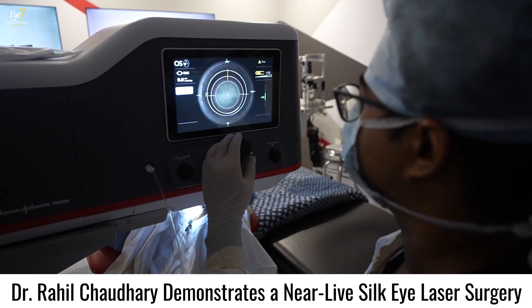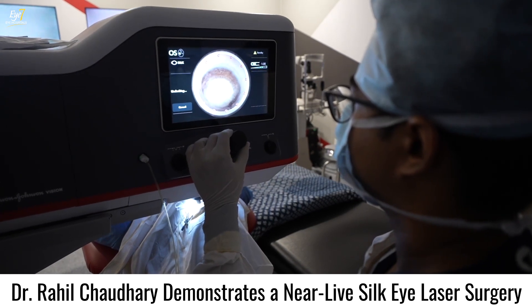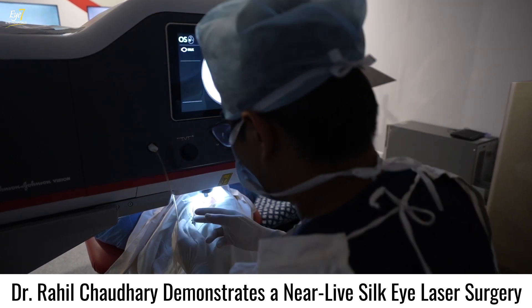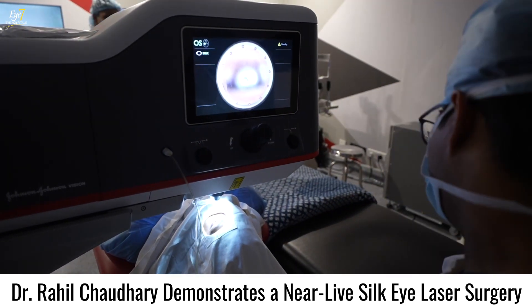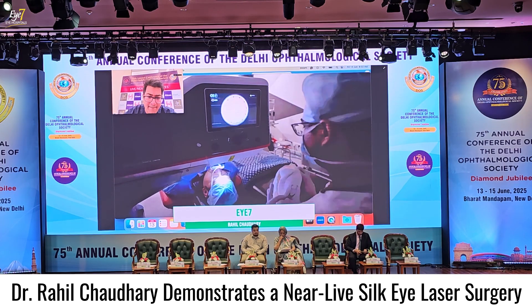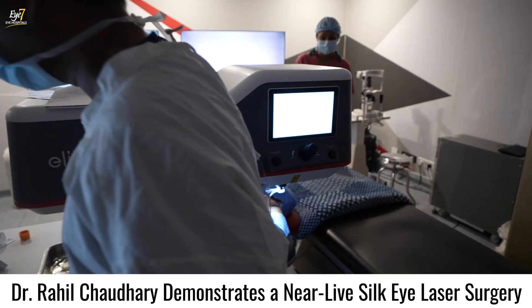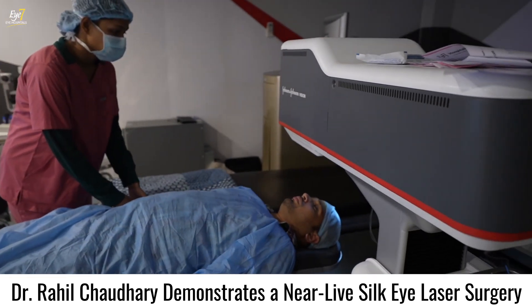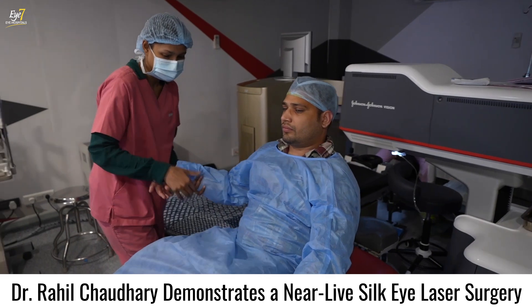Now we shift the patient under the microscope. Undocking is done. Throughout the procedure it is comfortable and the patient doesn't feel too much pressure. I have organized the operating theatre so that we finish with the first machine and then shift the patient to the EX500 excimer machine, using the microscope of that machine.